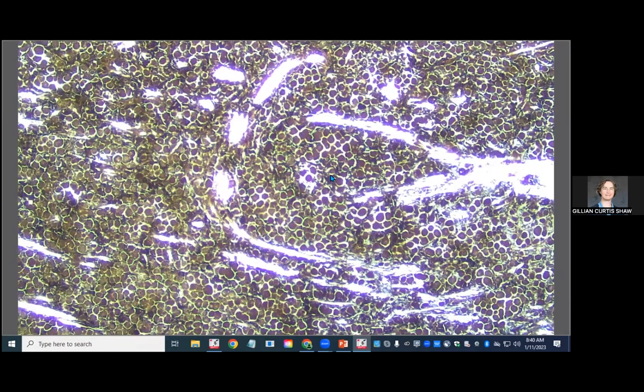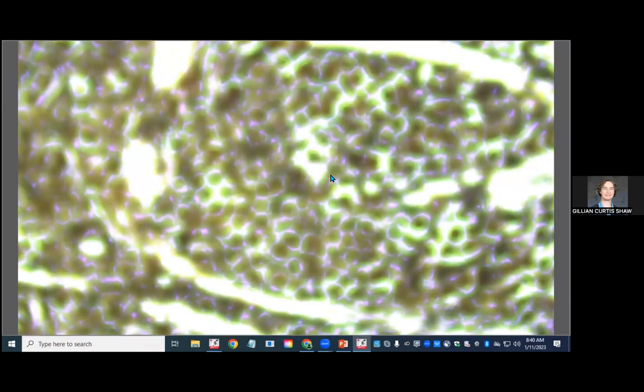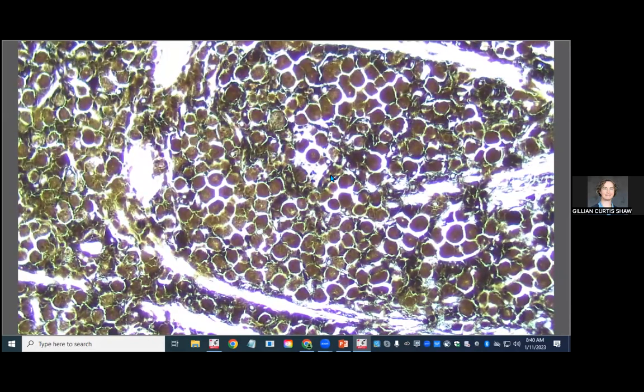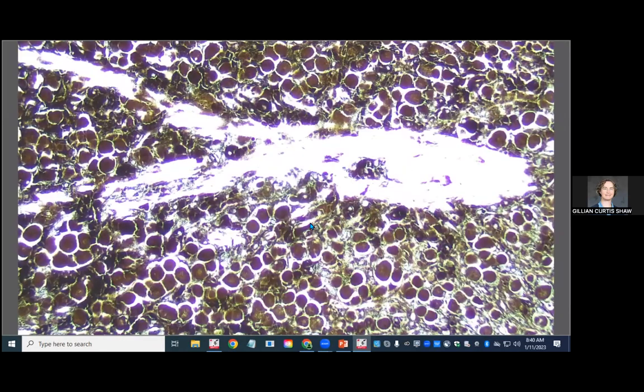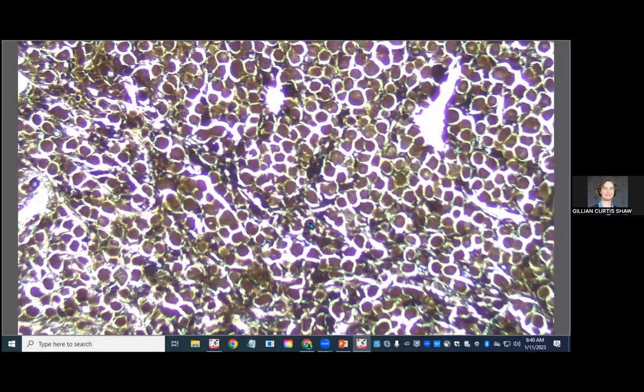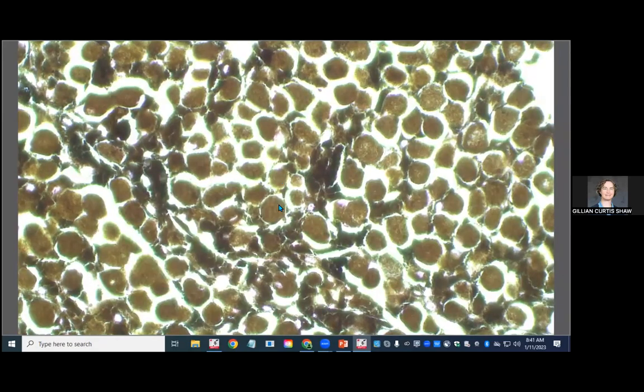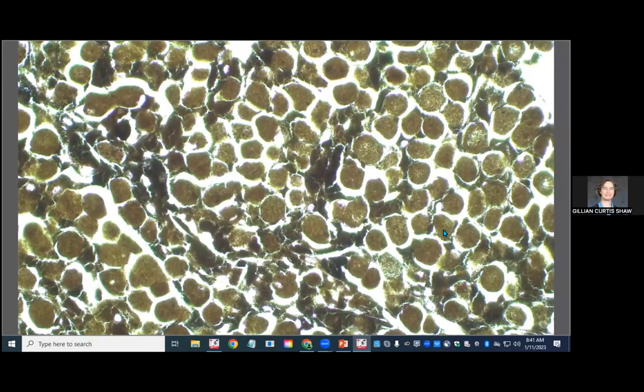Cameras never like darkly pigmented tissue, so it all gets weirdly distorted in green and pink and can't decide what it wants to do. But what we do see is that a lot of the cells in here are very large, polygonal to round cells with distinct cell borders and a lot of very heavily pigmented cytoplasm. You can't really see their nuclei. And then in the background, there are also some other pigmented cells that are more spindle to stellate shape.